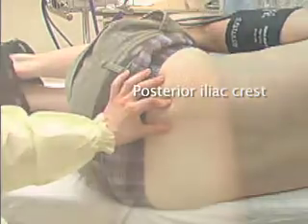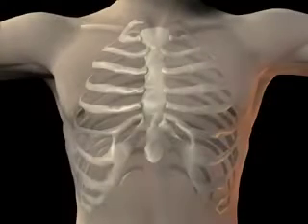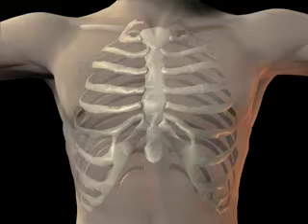If there is a reason not to use the posterior iliac crest, bone marrow aspiration from the anterior iliac crest may be performed. Though the sternum can be used to obtain a bone marrow aspiration under exceptional circumstances, it is not suitable for a bone marrow biopsy.